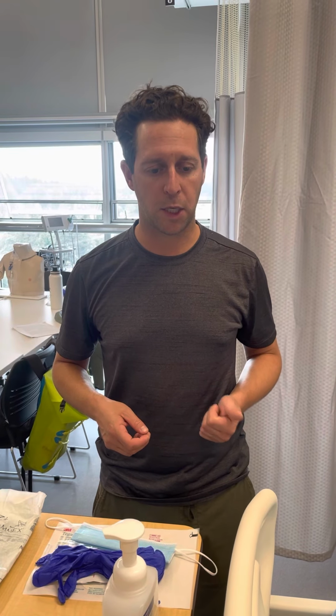I've checked the patient's chart for allergies. I've checked the CVAD policy guidelines for a dressing change, and I've checked the CVAD care plan for the type of dressing, the location of the dressing, the initial measurement, the date of insertion, and the due date for the dressing change. The skill that I'm going to be performing today is the CVAD dressing change, the site assessment, and flushing the lines.